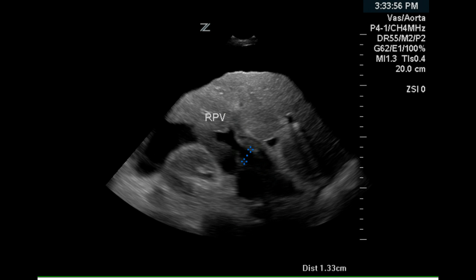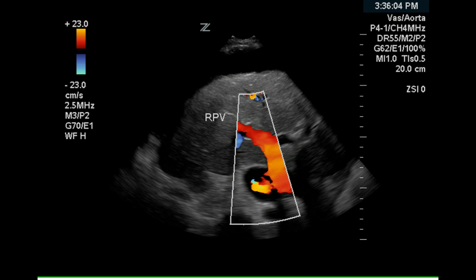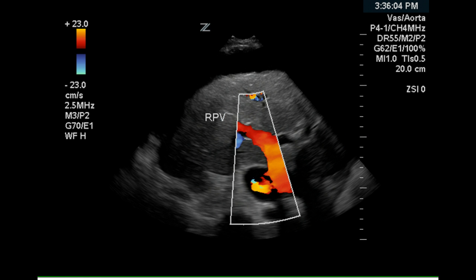The right portal vein is greater than 1.0 centimeters, and although there are no criteria for this vein, this is rather large. There is complete filling of the main portal vein into the right portal vein as demonstrated by color doppler. The flow is toward the top of the screen and therefore hepatopetal.